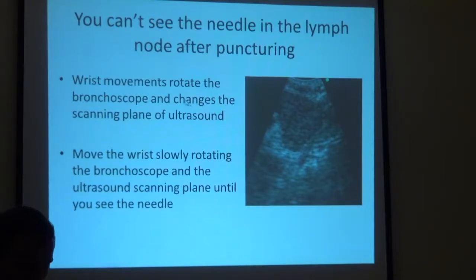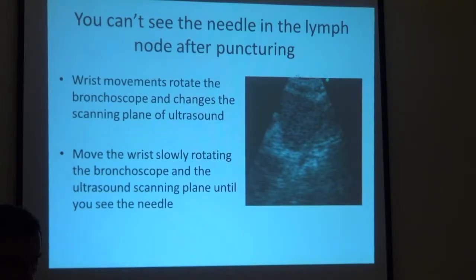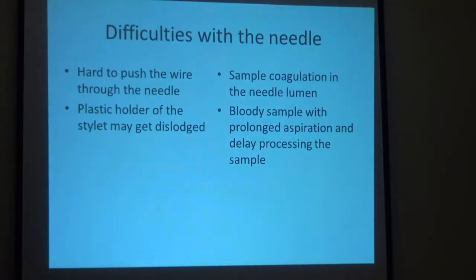It can be confusing for a second. You just have to remember, oh, where's my needle? Sometimes you think, did it go too superficial under the cartilage, or what happened? You can also have problems with the needle itself.